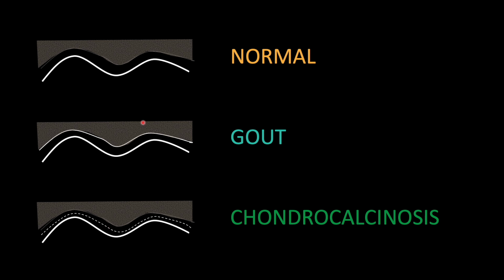And so the appearance that you see here can help differentiate between a normal knee, a gouty knee, and a pseudogouty knee. Now, obviously, aspiration and crystal visualization is going to be the gold standard for making these diagnoses, but I think it is important to remember.